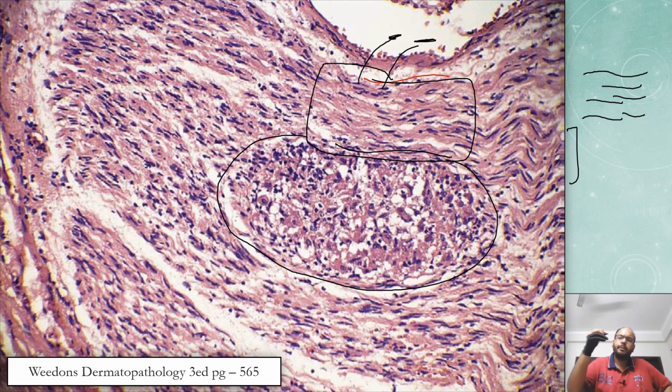They're located at mid to deep dermis. They are spindly eosinophilic cells with basophilic, elongated, flattened nuclei with pointed ends, which are located at the center of the cell body. Let's move forward.